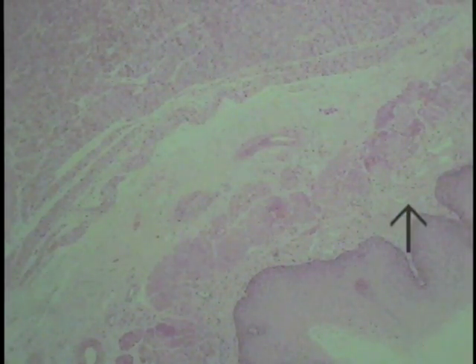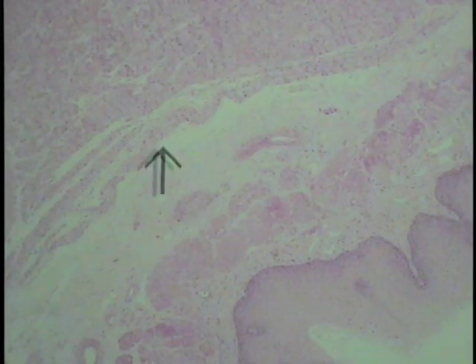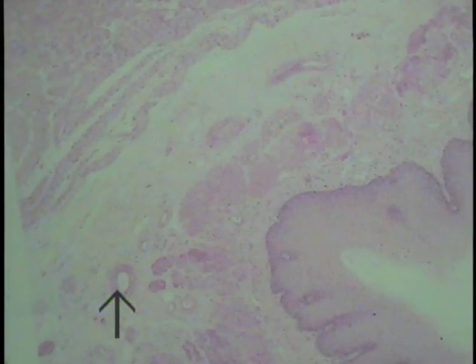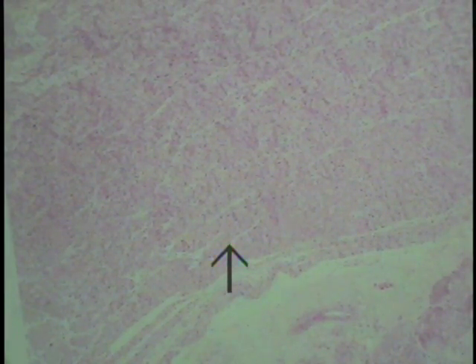The muscularis mucosae separates the connective tissue of the lamina propria from the underlying submucosa, which, as in the previous section we saw, also housed the larger vessels, and occasionally, depending on where the section was taken from, one should also encounter esophageal glands. The remainder of the wall is made up of, in this cross-section, an inner circular layer of smooth muscle, which is extraordinary in its dimensions.